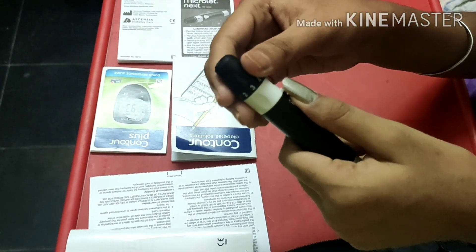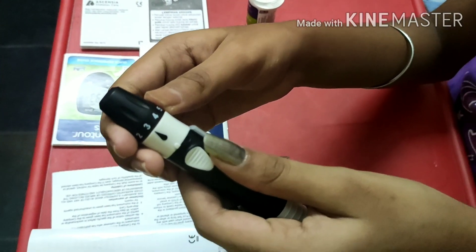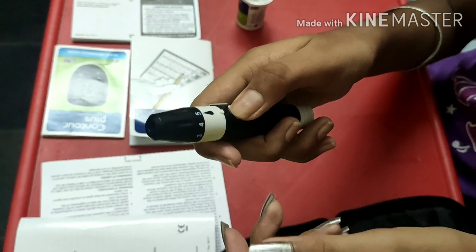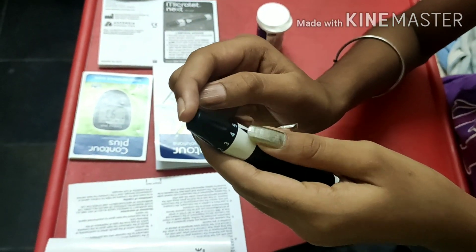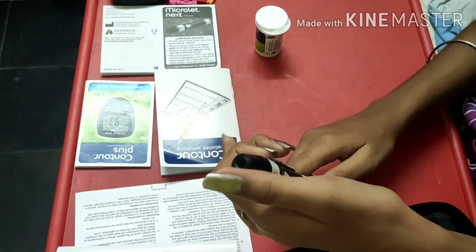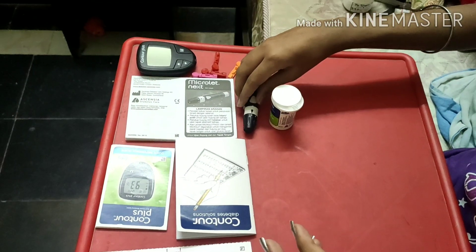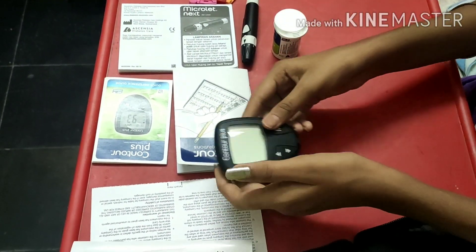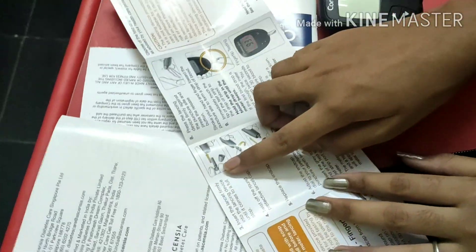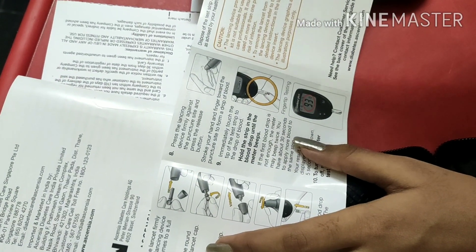If your skin is thin, you should set it to level two or three. If your skin is thick, set it to four or five. You drag and click on this, keep your finger on it, then pull and click. The device also shows how to open, how to close, and how to use the glucose test strips.